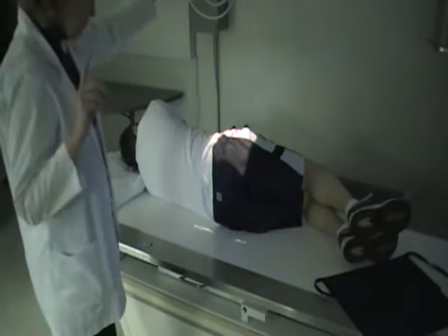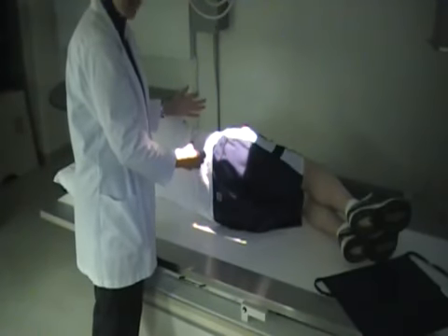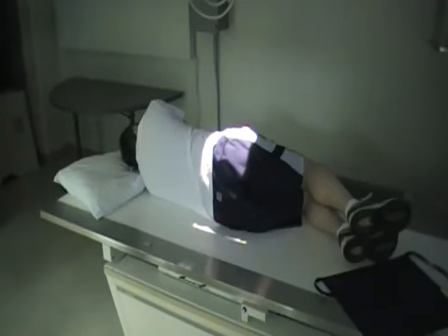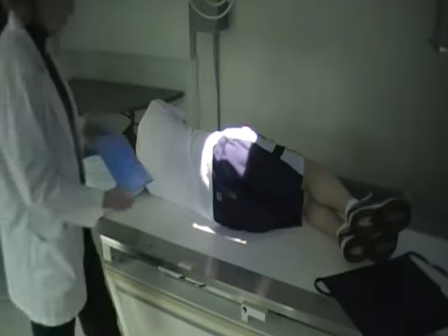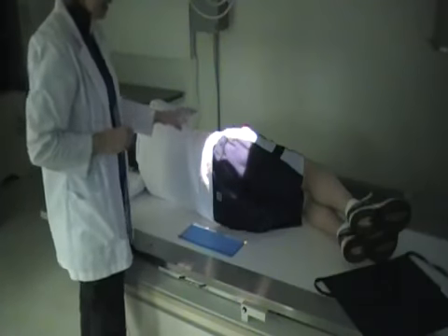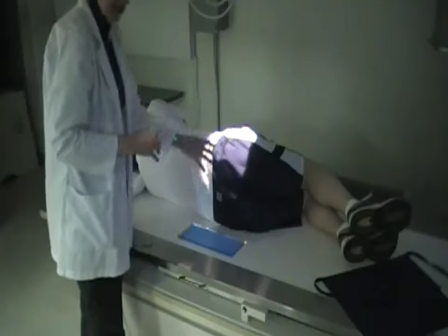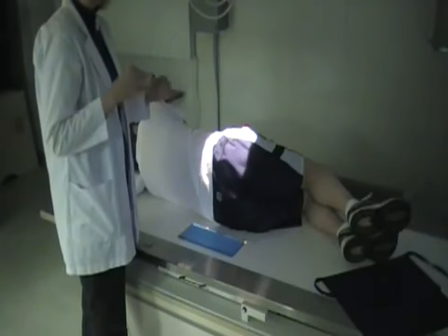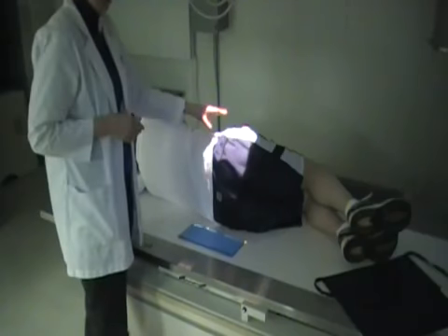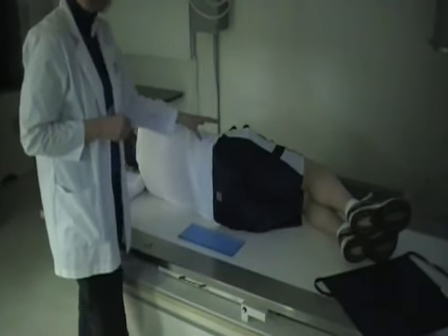One more thing. Because we are going through such thickness in the patient, it also helps if you put a little bit of lead shielding posterior here. And what that does is that helps cut out the scatter radiation that is bouncing out of the patient, and you have less scatter on the image receptor. So that's a good tip to use whenever you're doing the sacrum coccyx.